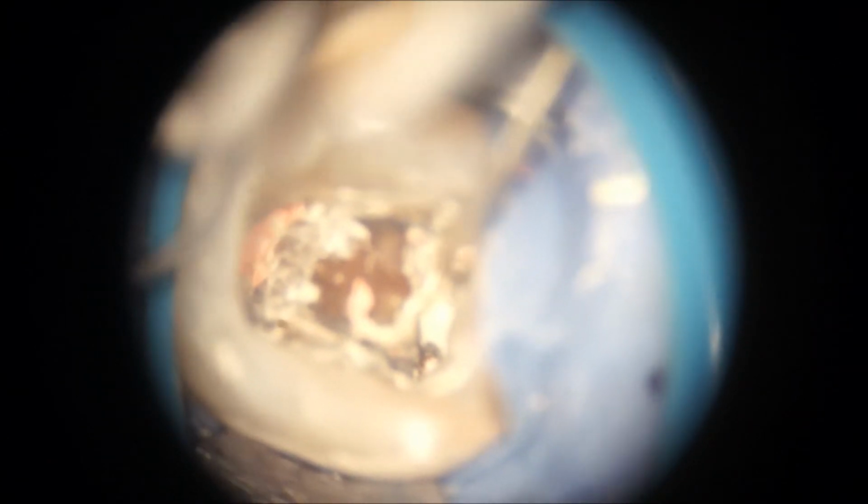Filling out the core of the tooth is also a debatable issue. In my view, the internal anatomy was damaged so badly by previous attempts that there are too many undercuts to consider a lab fabricated post and core made of metal. My second consideration was the fact that this tooth was probably for a couple of decades exposed to Eugenol.